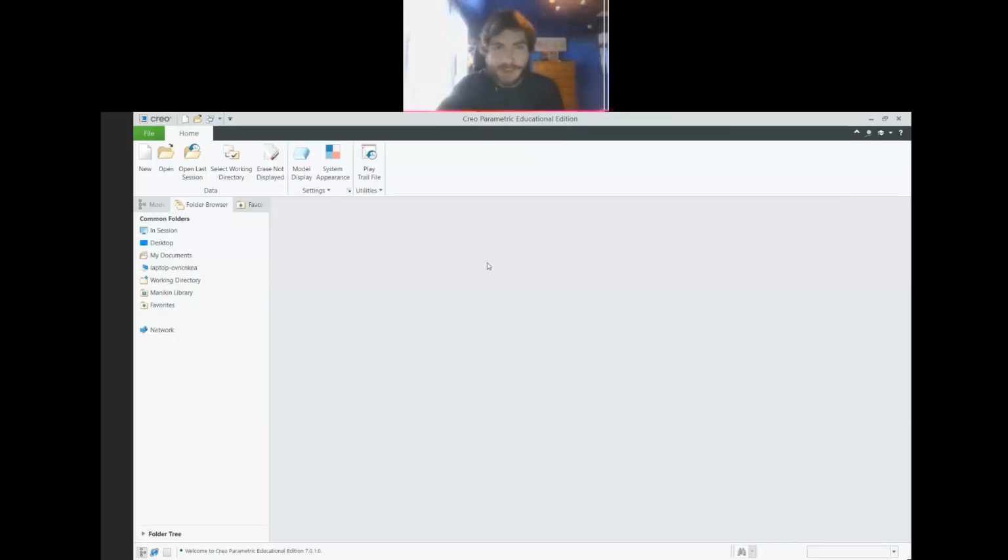Okay, so hopefully you all are on the Creo opening screen. Creo is a little bit weird. Unlike any other program you've ever used in your entire life, you have to choose where you want to save your files before you make a file.